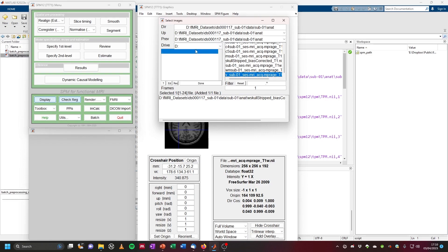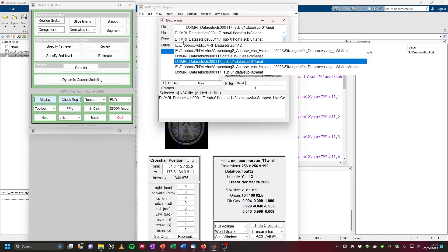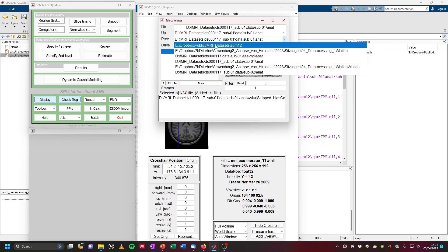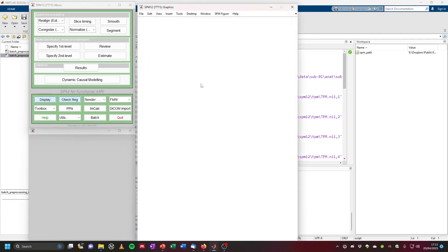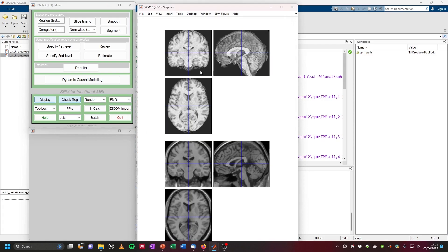Then we want to choose a standard MNI space image. Click on prev to go to previous, navigate to the SPM 12 folder, canonical, and select the single subject T1 — this is an example image of one subject in MNI space. Now we have these two images: at the top our warped normalized image of our subject, and at the bottom the template.